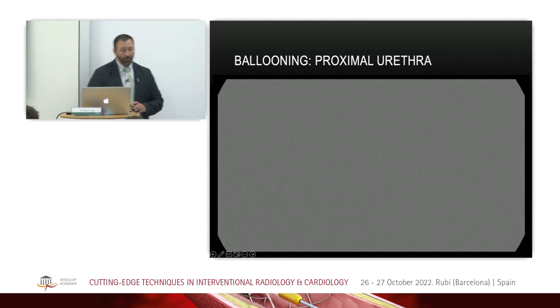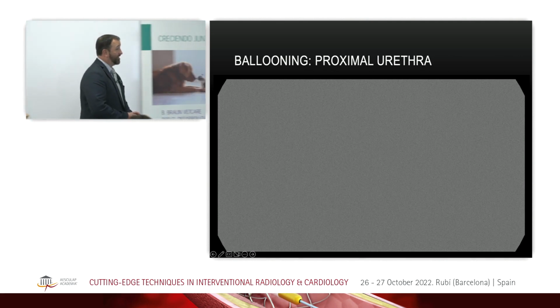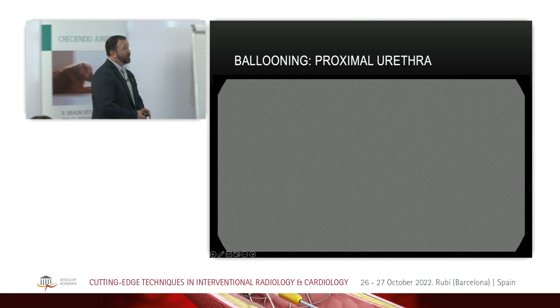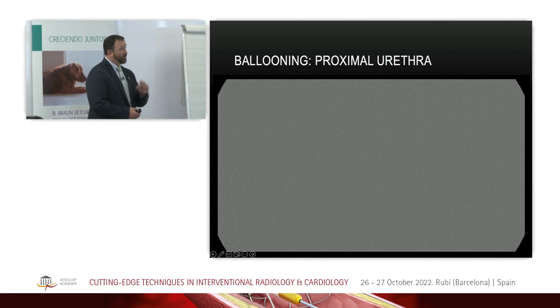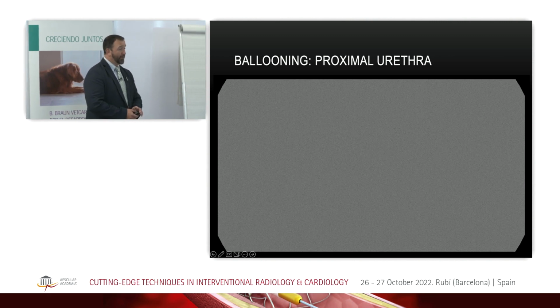Yeah, so if it was a cat, we've stented cats in this situation. So usually cats are like 4 or 5 millimeter diameter stents, so we'll place stents in them as well. We would potentially place like a red rubber catheter and suture it in place if we didn't have a stent available, but then plan on placing a covered stent afterwards.